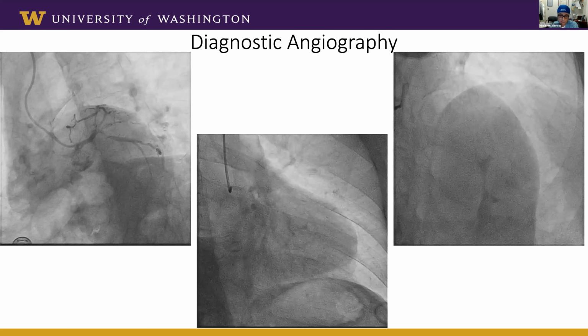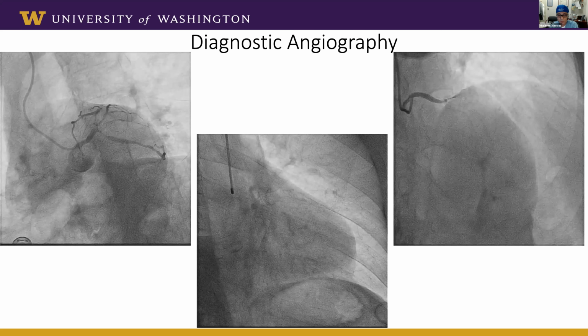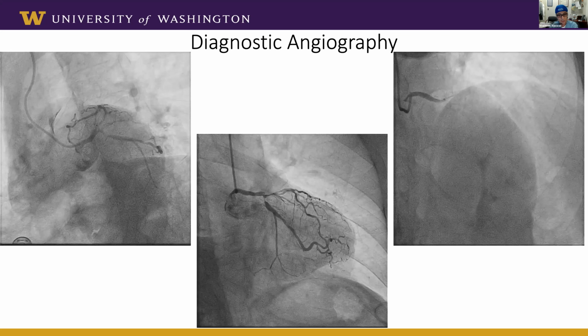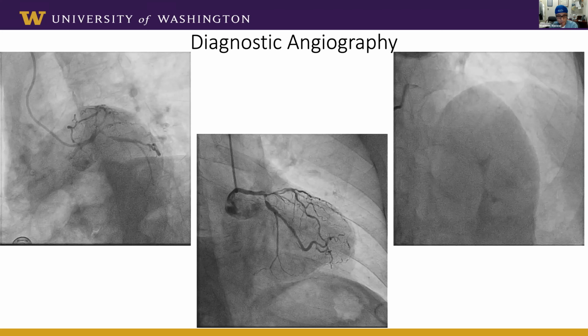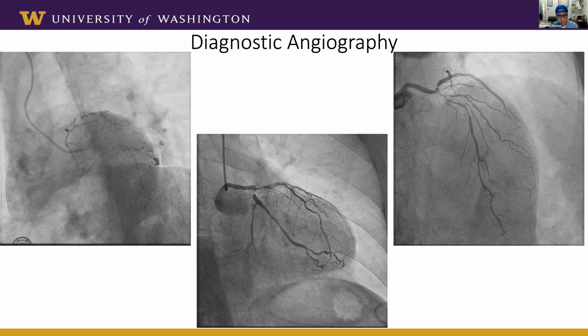You can basically make it simple. Treat the diagonal provisionally at the ostium, but you have to treat that lesion there, and then treat the LAD circ. And I'll probably dilate the ramus just to keep it. And then if the patient has symptoms down the road, I can bring him back and do something else.